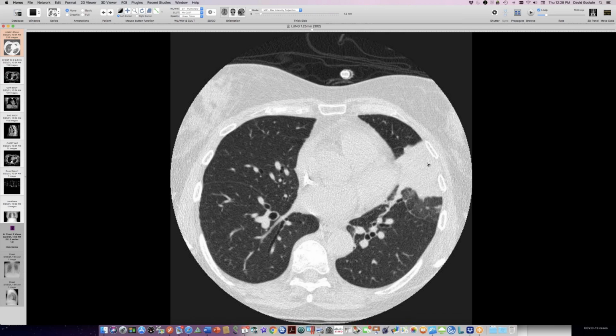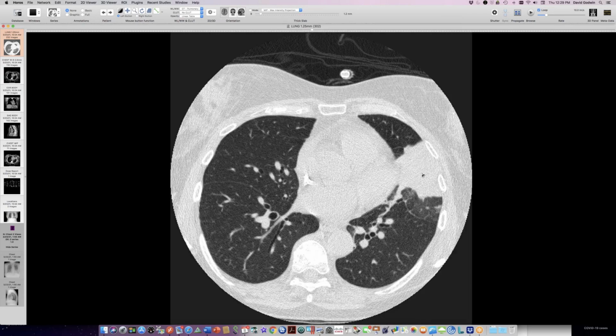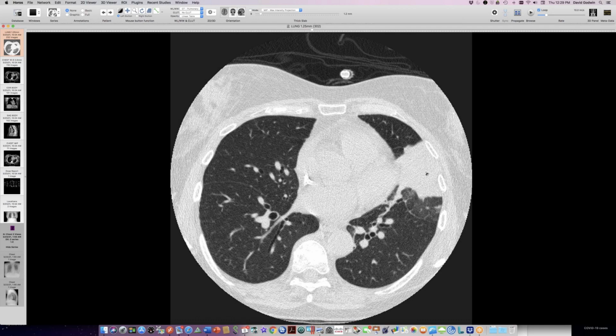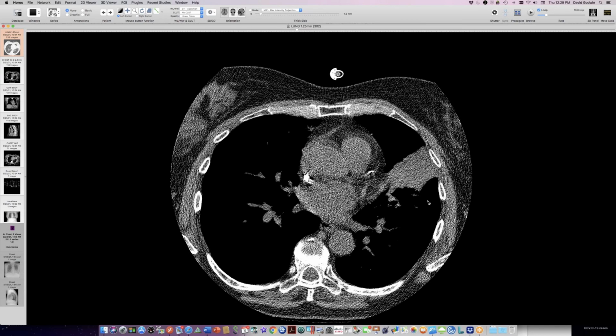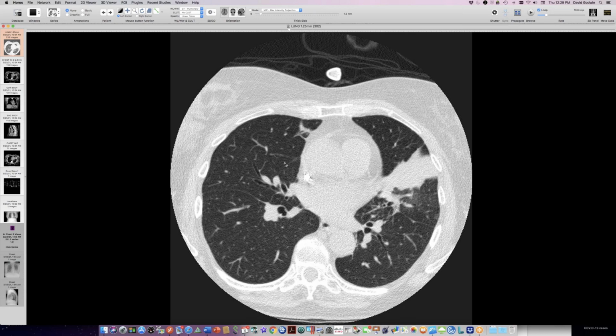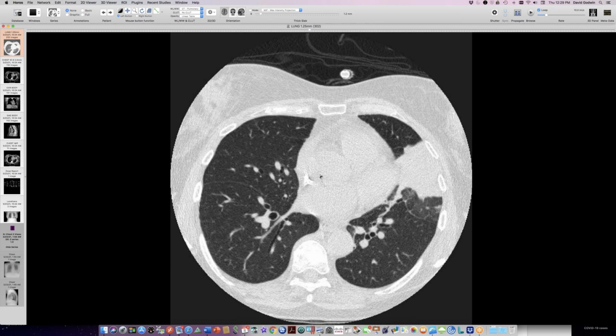This would be great for some sort of zygomycete or aspergillus even, or nocardia. Those are my choices. And then in terms of bacteria, I would throw in, besides nocardia, the possibility of Legionella micdadei. It likes to form compact masses that look fungal. So sort of ambiguous here, fungal versus bacterial. And there are a couple of other littler things, but that's probably just atelectasis. It's nothing too striking.